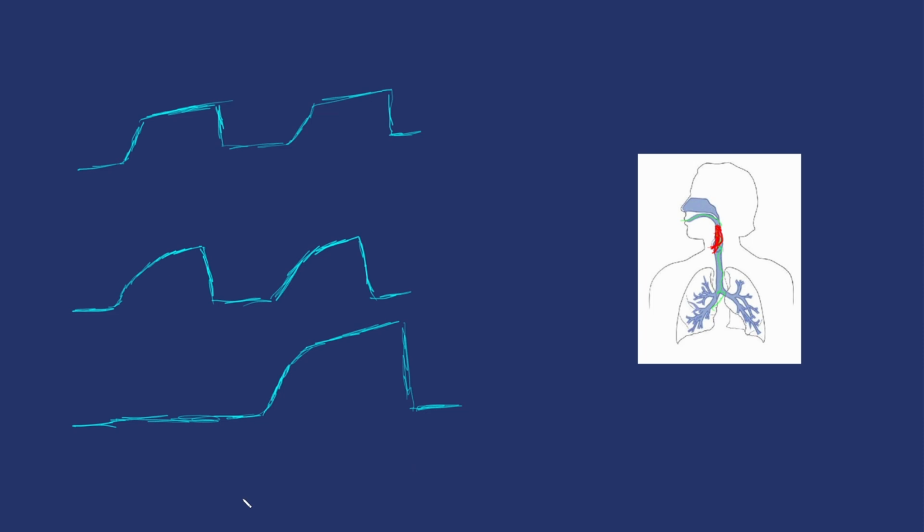And that's when we're going to see one of those physiologic responses again, as the CO2 is building up in the lungs, needs to be kicked out. So you'll see a higher end tidal CO2 in that case. So as we look at our end tidal, we'll start seeing waves that are more like this, and it'll be drawn out again and again as it's repeating.